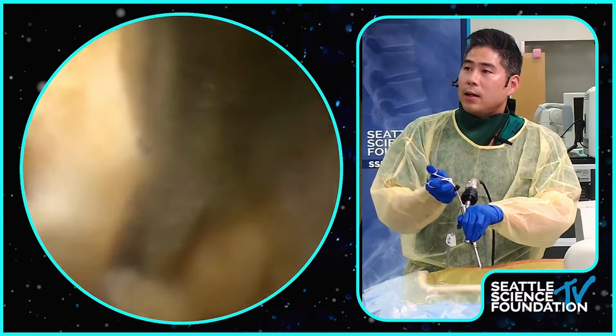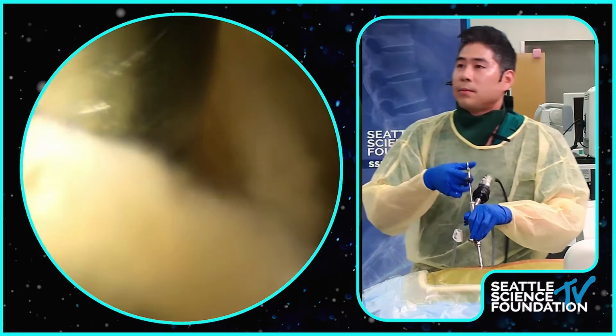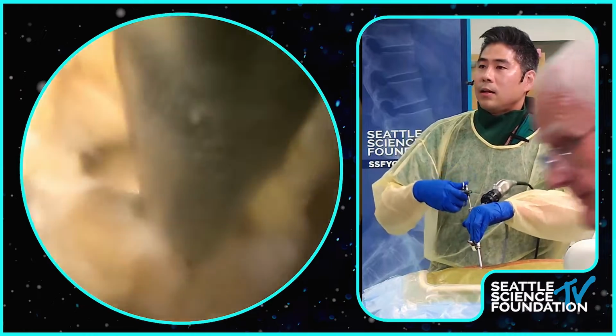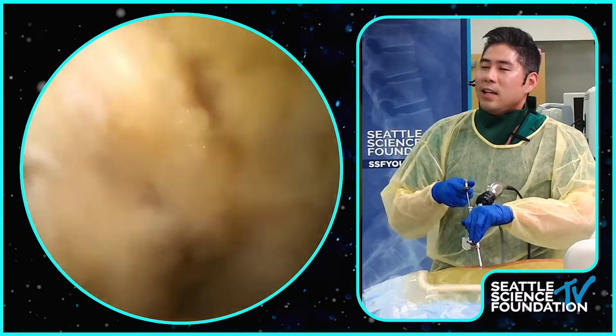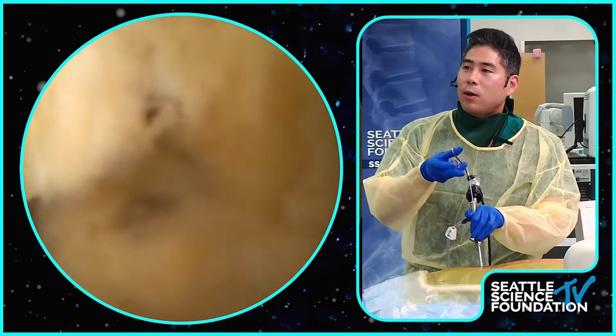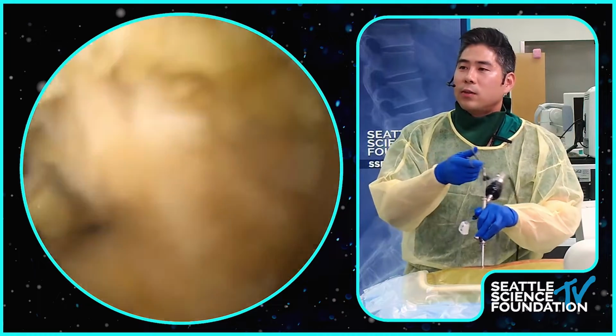And John, I think it's really important that we're looking at your hands. I know that for transforaminal versus interlaminar, transforaminal is very easy in your hands, but interlaminar, it seems like a lot more is going on. Yeah, so that's a great point. So with transforaminal, you're sort of stuck in that one direction where you come in. With interlaminar, you actually want the degree of freedom.